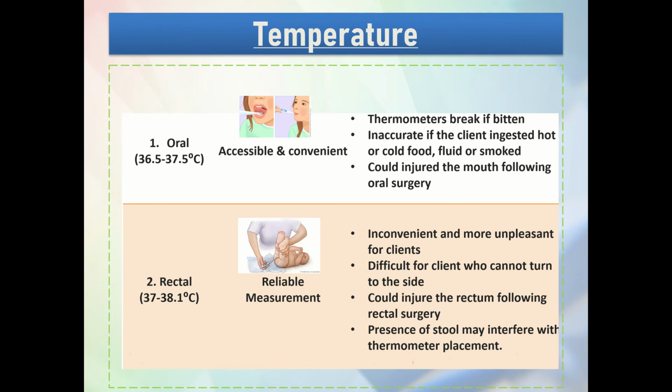Now, so in here, we have the different sites in taking temperature to our patients. And then, ano yung advantage and disadvantages. So let's start.